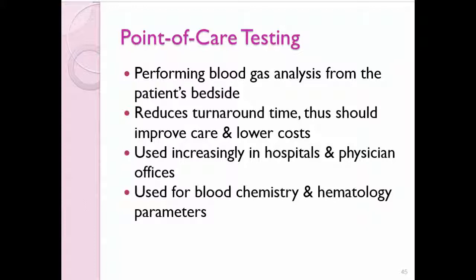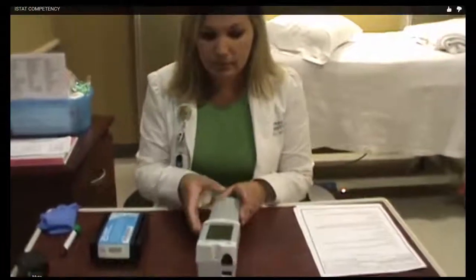The iStat is used at our medical center. It is a point of care device, and that's pretty much their go-to equipment. You typically do still have to have a blood gas lab and still have cabinet style equipment to use, especially for correlation if you have to change your analyzers. But they're going to point of care almost exclusively unless the freestanding lab analysis is required. I'll talk to you today about how to use the iStat. So let's get started.